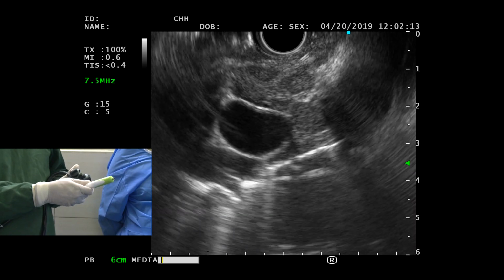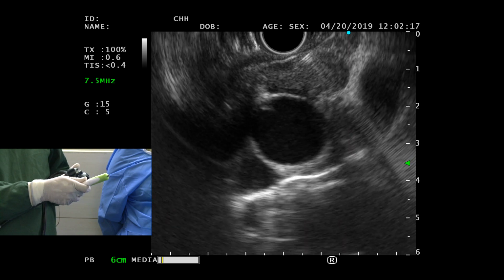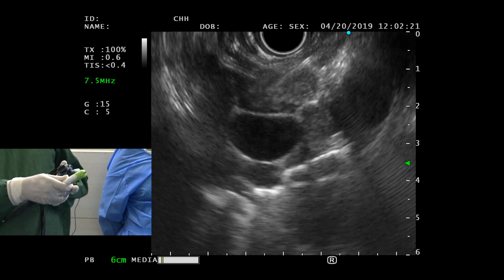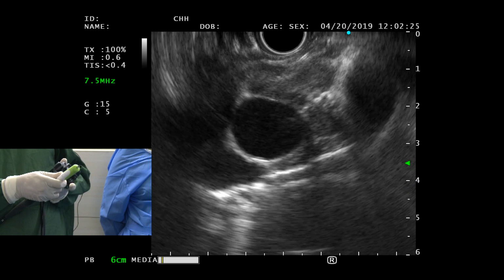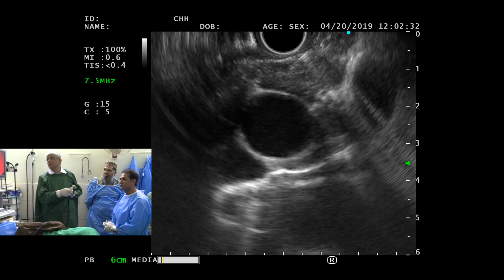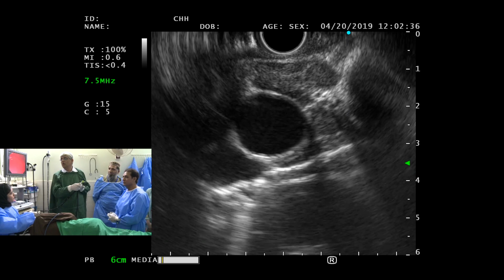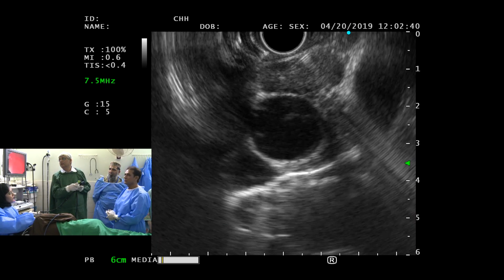Okay, so we are in this thing. This time I just need a... not getting the right place. I need to come here and go all the way. That's better.